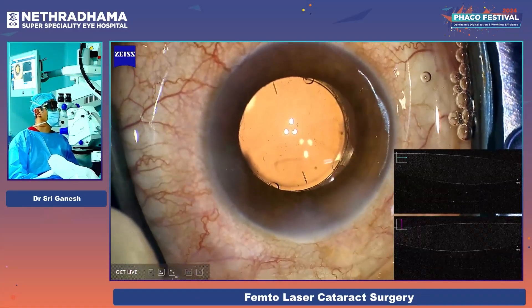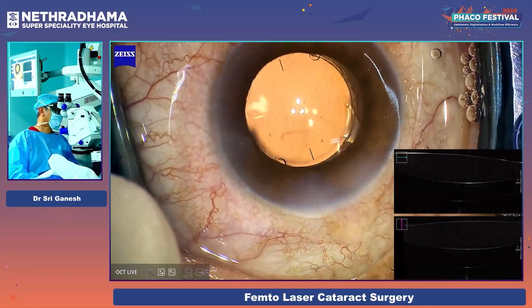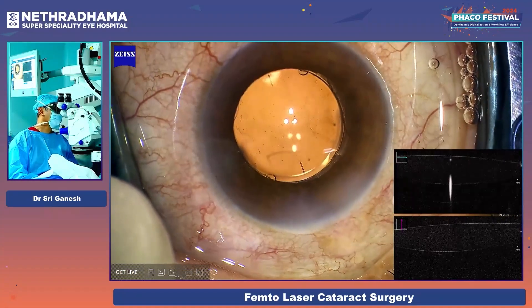I will also focus on the posterior aspect. You can see that's the lens — the posterior capsule is slightly offset but there is no visco there.